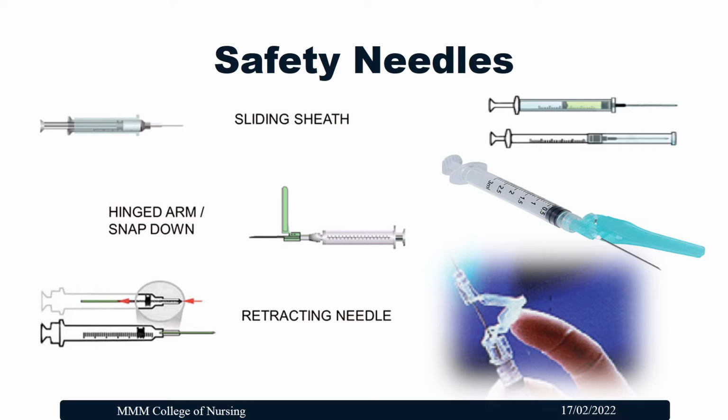The next one is the retracting needle. After the injection, the needle is retracted inside the barrel, so that the risk of needle stick injury is less.